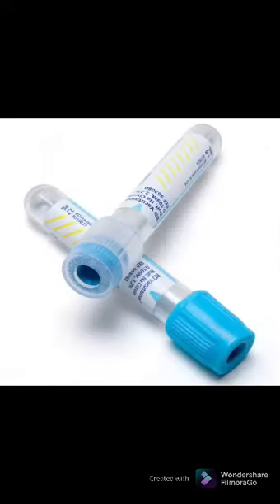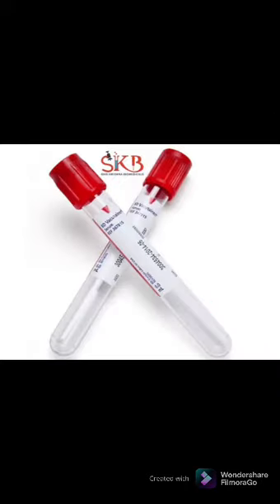Second, we have the blue top tube that has the sodium citrate additive. The function of that additive is to prevent blood from clotting by binding calcium, and it is found in the coagulation department.